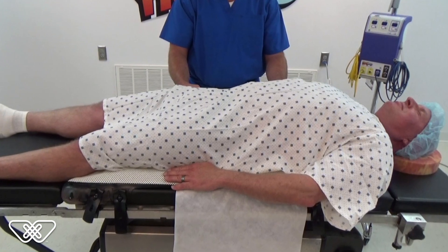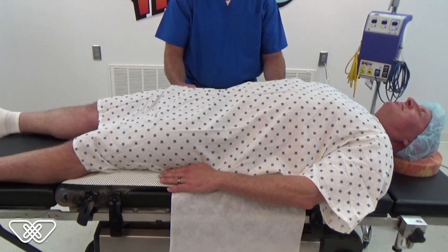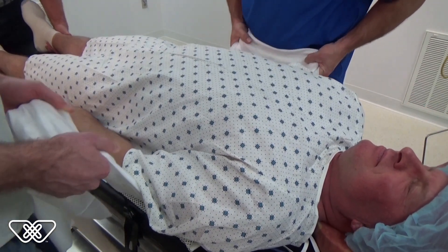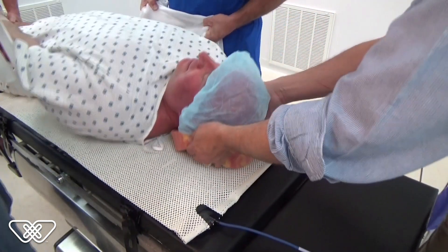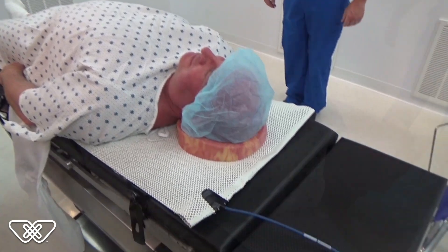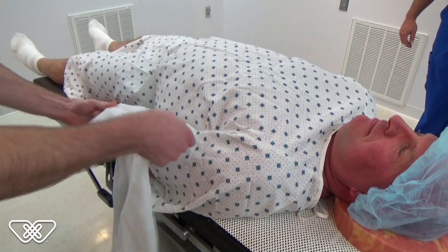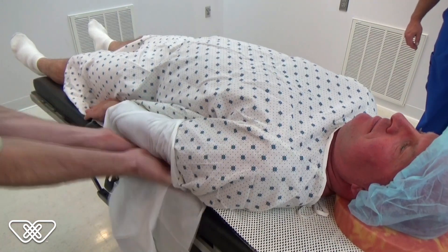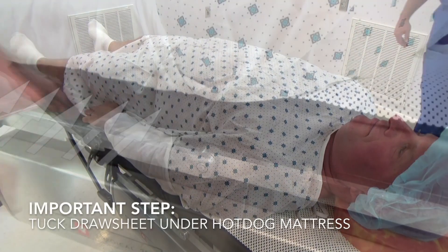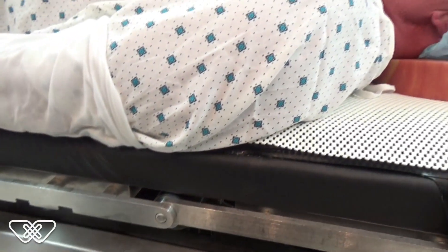Ensure that there are no obvious lubricants on the patient's back that may adversely impact the friction surface. Use the Waffle Grip draw sheet to reposition the patient if necessary after induction of anesthesia. After the patient is in the proper position, secure the arms using the draw sheet. The draw sheet goes up near the patient's torso, between the arm and the body, and then wraps around the arm. It is secured by tucking it under the warming mattress. Do not tuck between the patient and the Waffle Grip material, as this will decrease the friction surface.